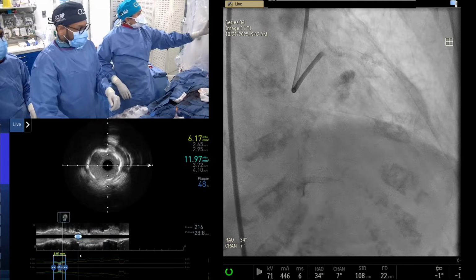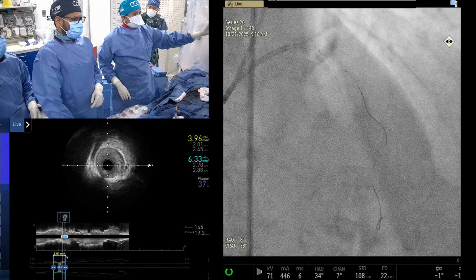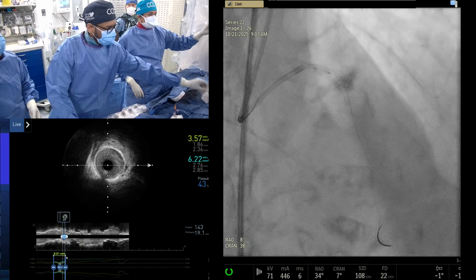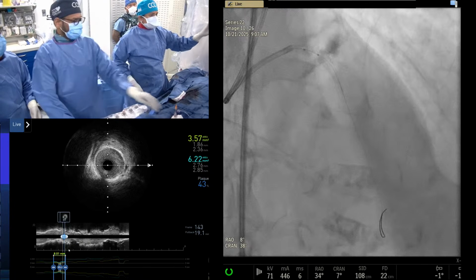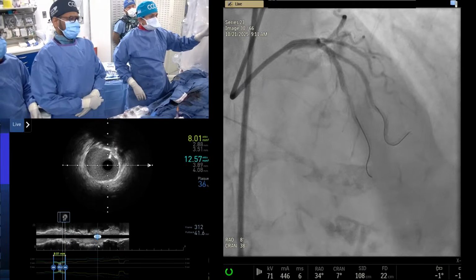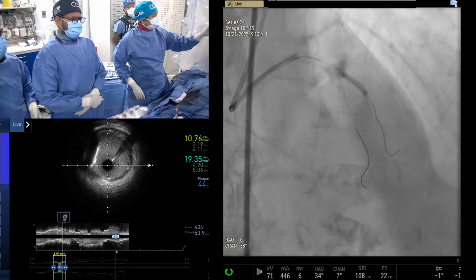Okay, so I just need to show you one thing when we were recrossing. Where are we? Yeah, we did all that, right? Was it this? Yeah, this was the post you saw, right? We recrossed. Yeah. We had left you around this point.